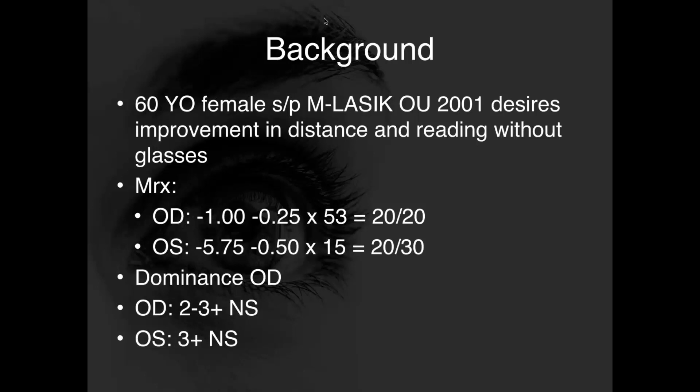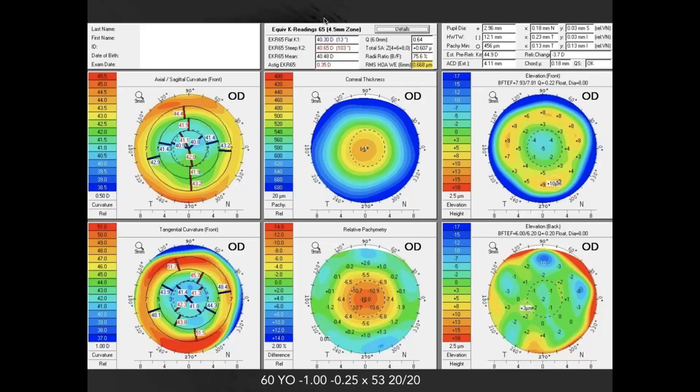When we look at this report from our AXL—one of the Holladay reports—it gives us useful information starting with the axial and sagittal curvature in the top left. This looks like a fairly typical post-myopic patient with what I call reasonably regular, irregular astigmatism—irregular by definition since she's had LASIK previously, but not wildly irregular. This can be accentuated with the tangential curvature map, and we can look at thickness, relative pachymetry, and elevation floats for the front and back, respectively.